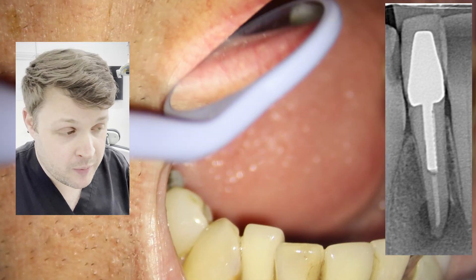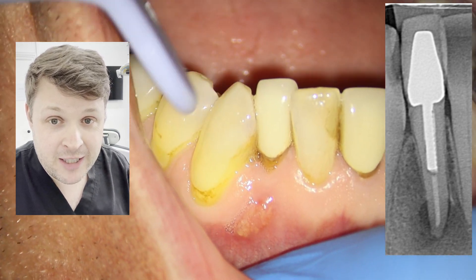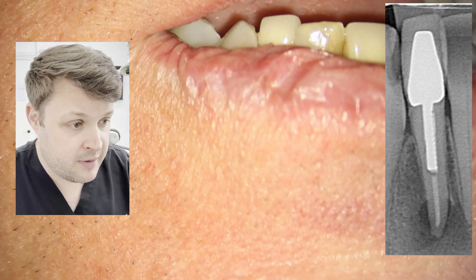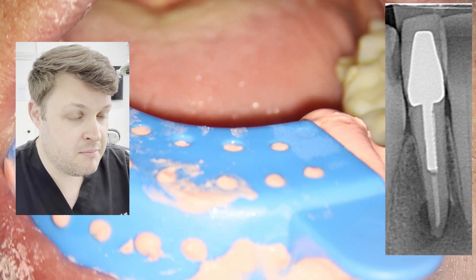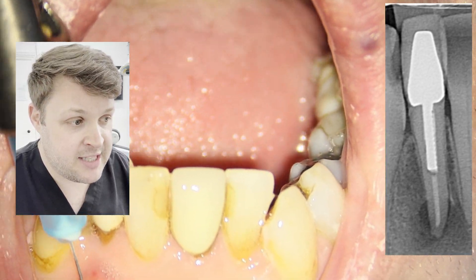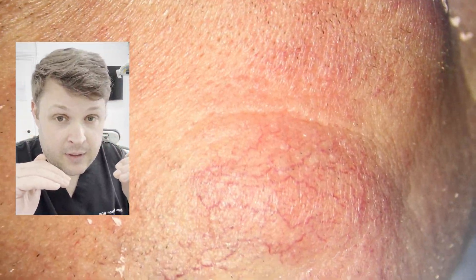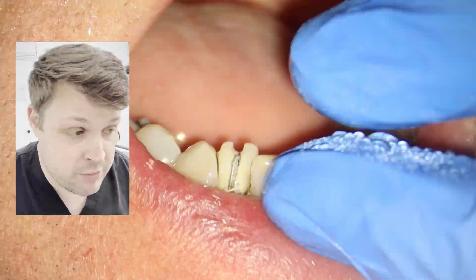This is a fantastic video demonstrating how to remove a very long serrated post. When we think about posts we want to remove, these are probably the most difficult. A fiber post is probably a little bit more difficult, but this is as tough as it gets. This post is serrated — it has little serrations in it — and it's quite long, making it very difficult to remove.